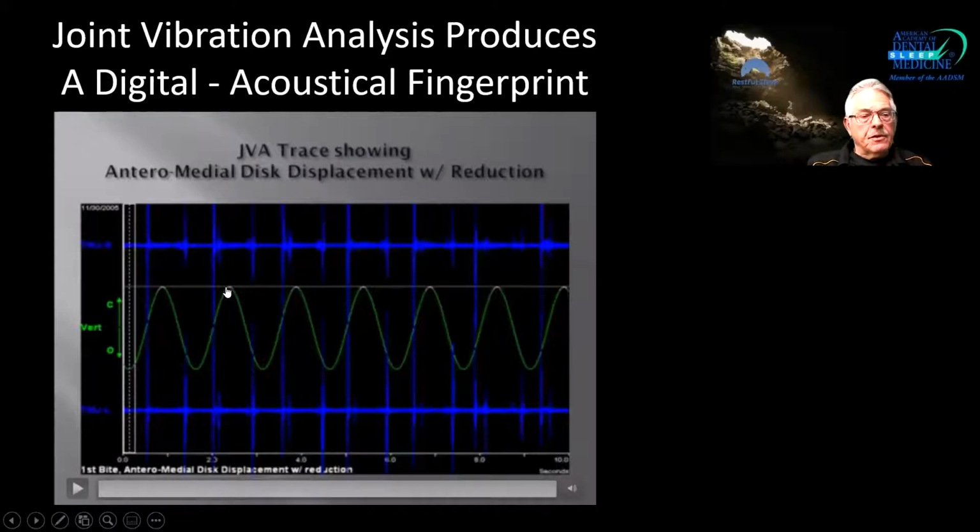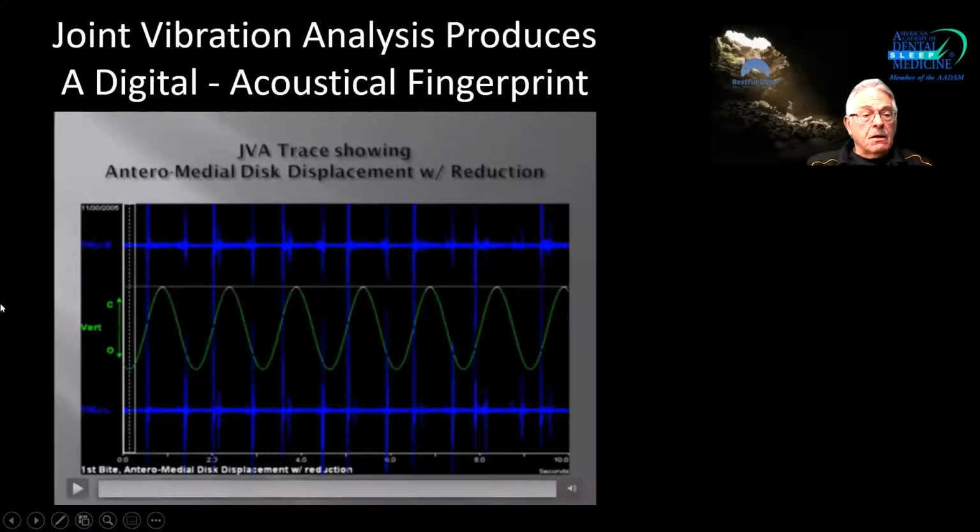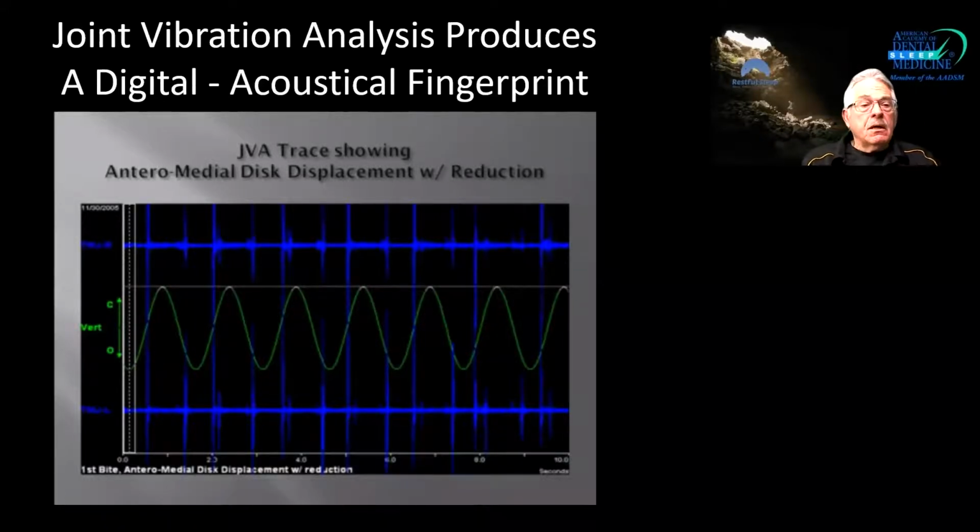So essentially, this is where the teeth come together. This is where you would pick up the vibration of tooth contact. But you can see here is a closing click. Here is an opening click, and you can just see the rhythmic opening and closing click of the condyle. You do not need this for sleep. Matter of fact, you don't particularly need it for TMJ, depending on what level you're doing it at.